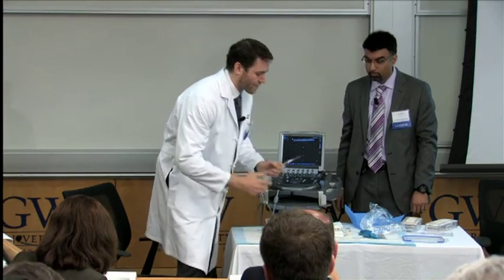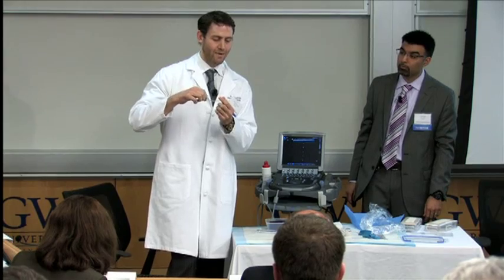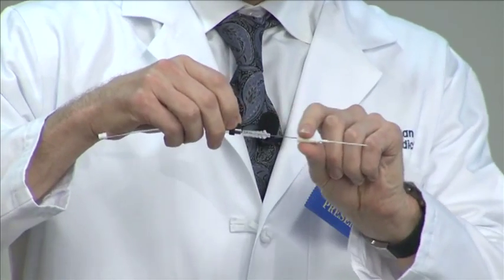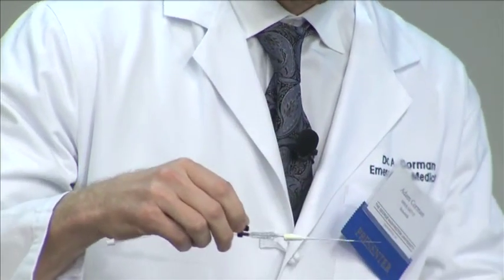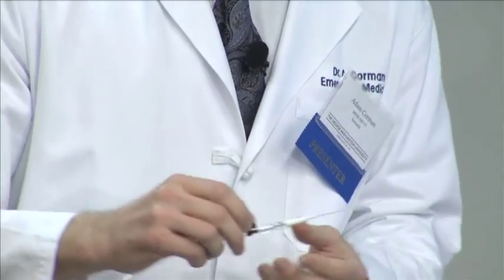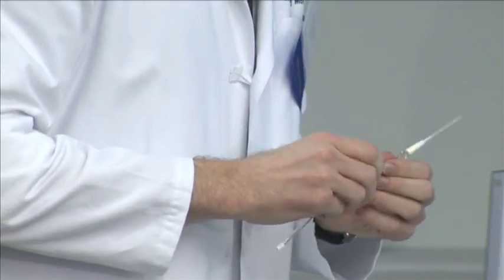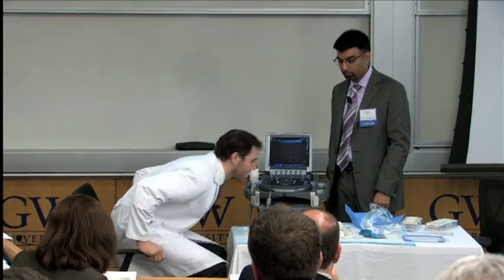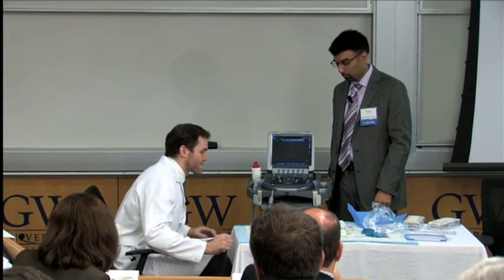This is a little bit more advanced. It has a guide wire here. So you place the guide wire, and then you put the catheter over it, and that goes into the vessel. And so you can visualize the guide wire, you can visualize the needle, but then afterwards you can't see the catheter. And I have to place this, so it usually takes 30 minutes to place an IV with traditional methods, so we'll see how it goes.